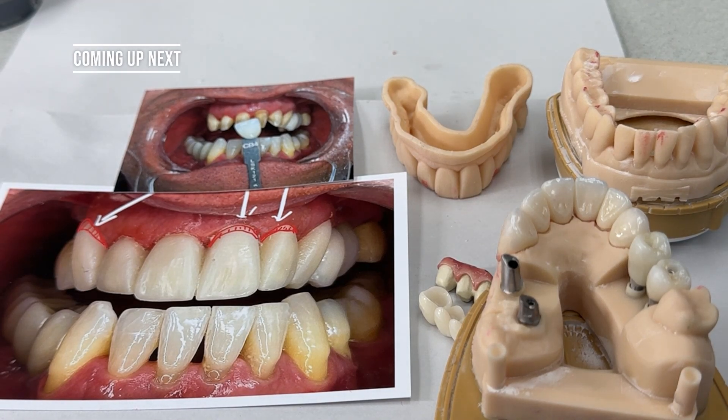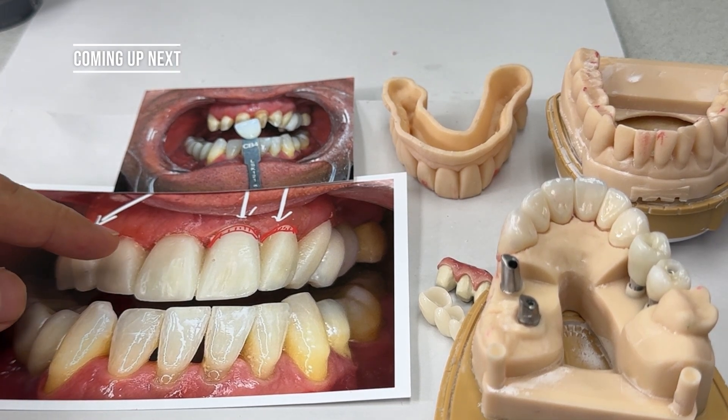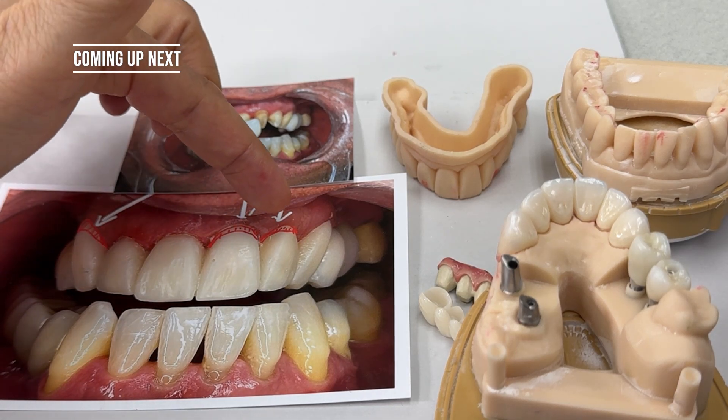This is the final full mouth case, which is a great case. The doctor gave us the information regarding the photo, and we have to make the pink porcelain here.